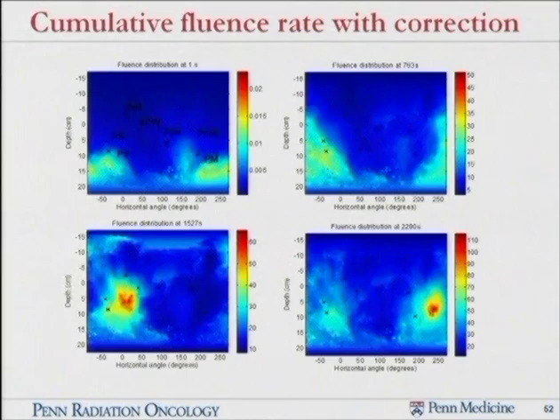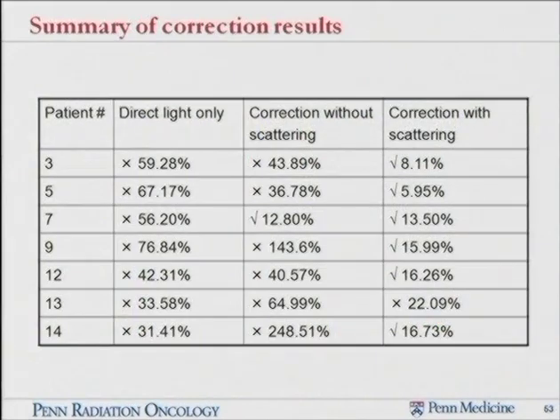So this is basically indicative, giving us a tool to decide how we can ensure the light distribution, and potentially, because it can be done in real time, you can have the surgeon use this method to paint the surface, basically, and become a painting method.